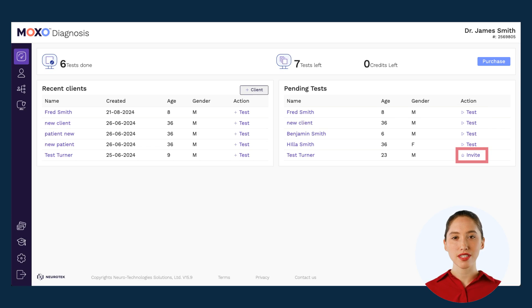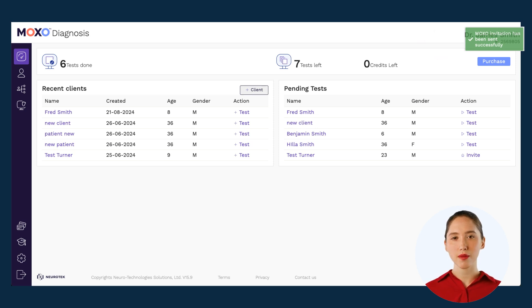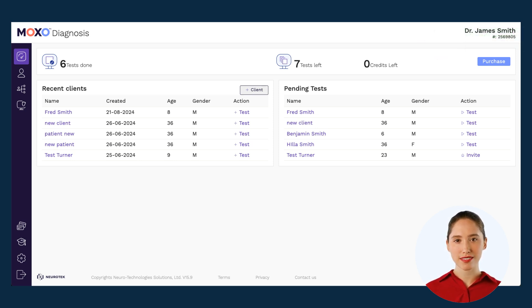Once you click on invite, a green window pops up at the top right corner of the screen indicating that an email with instructions and a link to start the test was sent to your client.